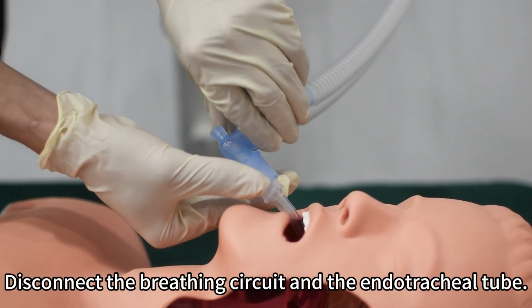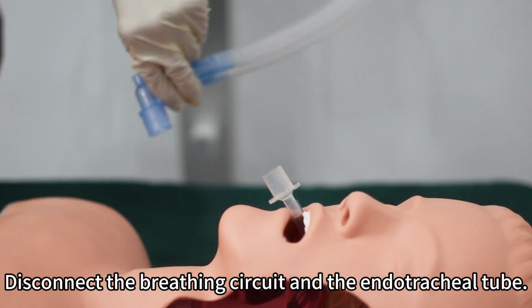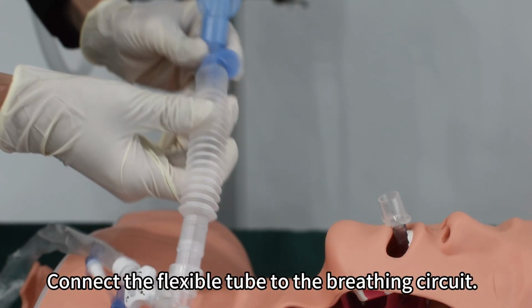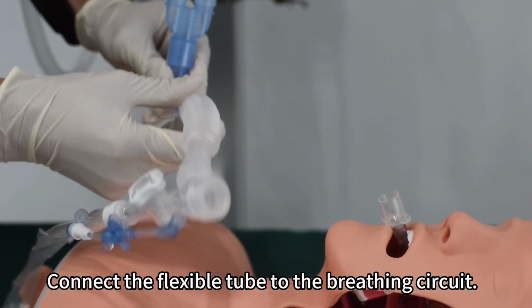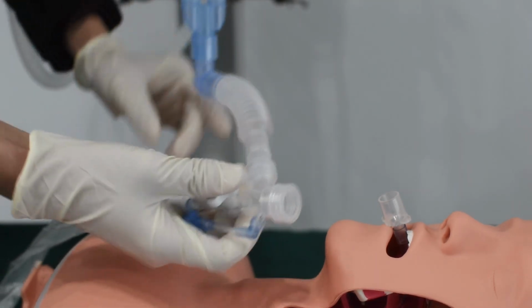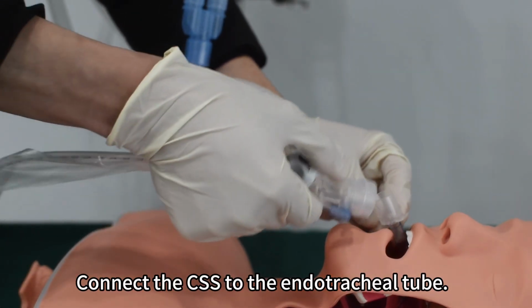Disconnect the breathing circuit and the endotracheal tube. Connect the flexible tube to the breathing circuit. Connect the CSS to the endotracheal tube.